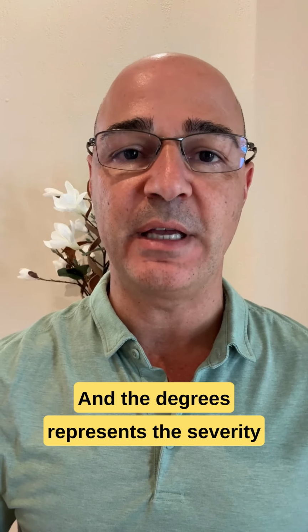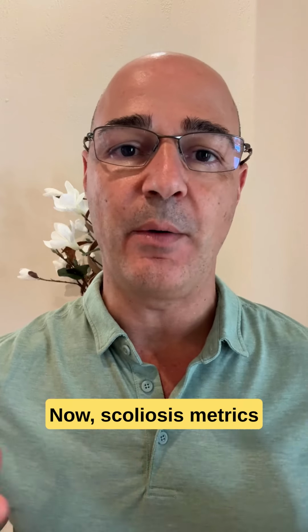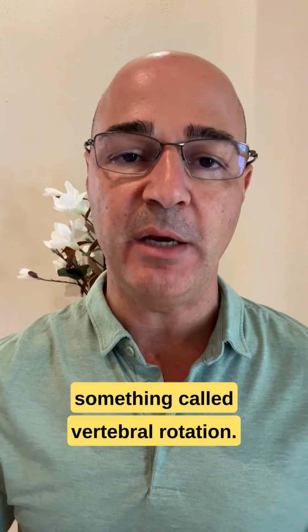And the degrees represent the severity of the curve, like I mentioned, and it's normally categorized into a mild, moderate, or severe scoliosis. Now, scoliosis measurements just don't include that. There are also some other measurements that can be taken, and that's something called vertebral rotation.